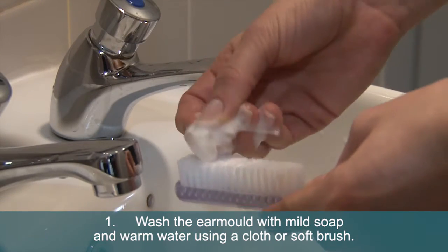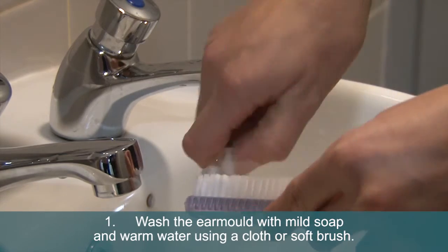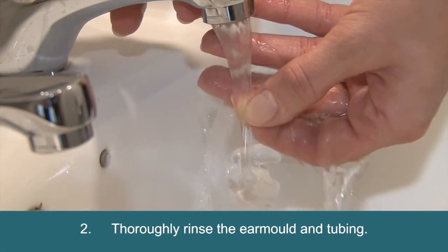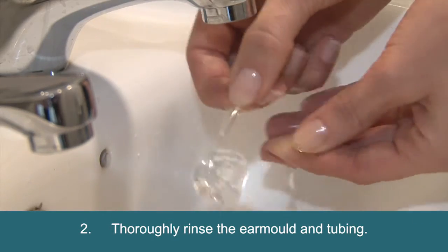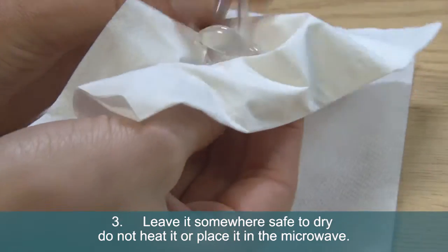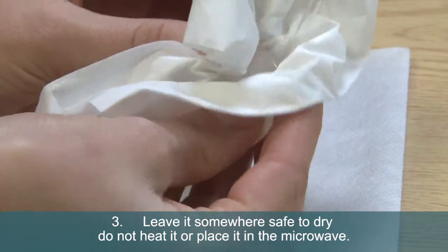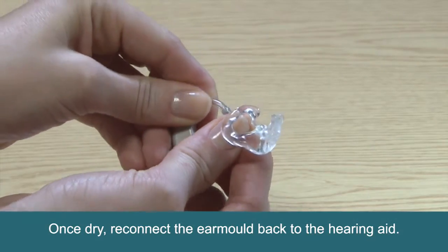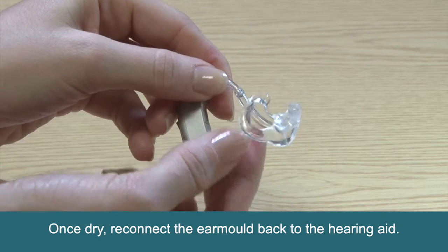1. Wash the ear mould with mild soap and warm water using a cloth or soft brush. 2. Thoroughly rinse the ear mould and tubing. 3. Leave it somewhere safe to dry — do not heat it or place it in the microwave. Once dry, reconnect the ear mould back to the hearing aid.